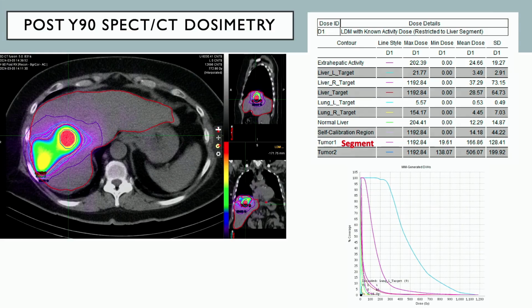And so you see that DVH curve that Nima has, it's the blue S-shaped line. And so the percent dose, I can't read it from there, but it's percent. At close to 100, you can see that the dose travels along the x-axis. And so at the top part of it, that is going to be where those two intersect. That's going to be his D99 or D95.